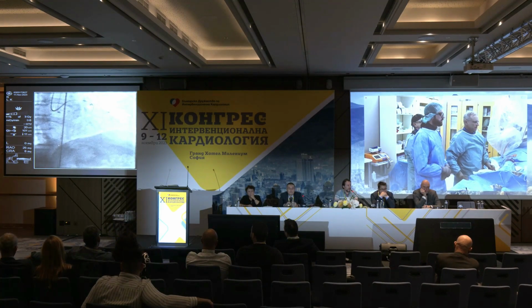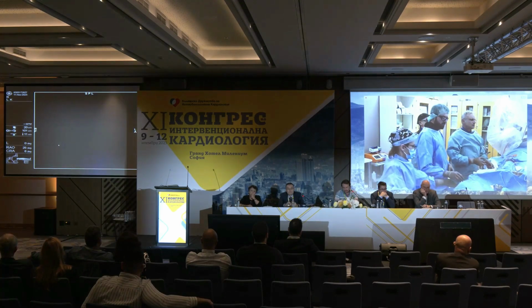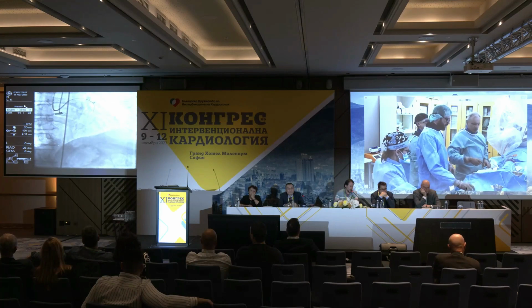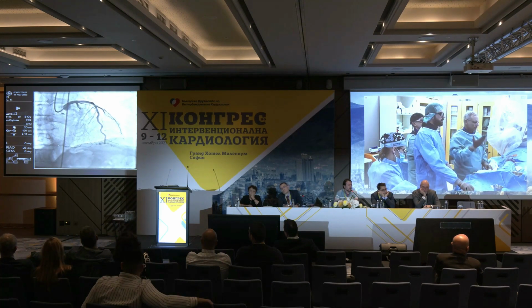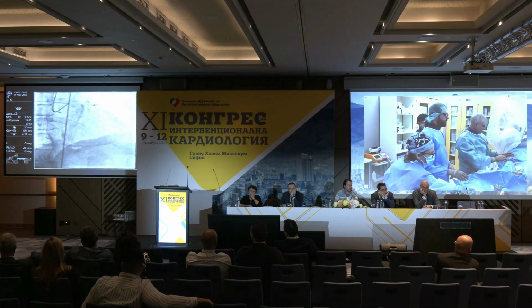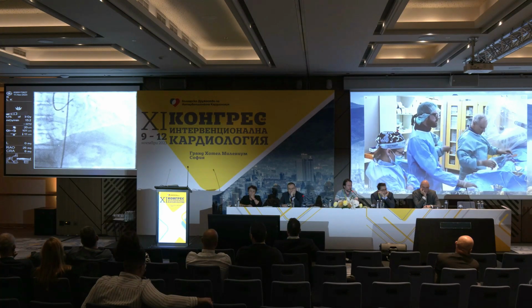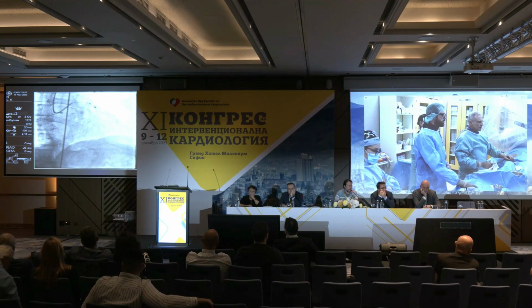Can you give us some insight about the microcatheter and the wire you are using now? The microcatheter is the Turnpike LP, let's make a film from that, is a Corsair XS Pro, and the wire is just a Sion Black wire. What I'm saying is, when you're implementing retrograde techniques, when the prospects of the retrograde wiring are as good as this one, I think you should not hesitate. Let's see how this microcatheter is going to track.